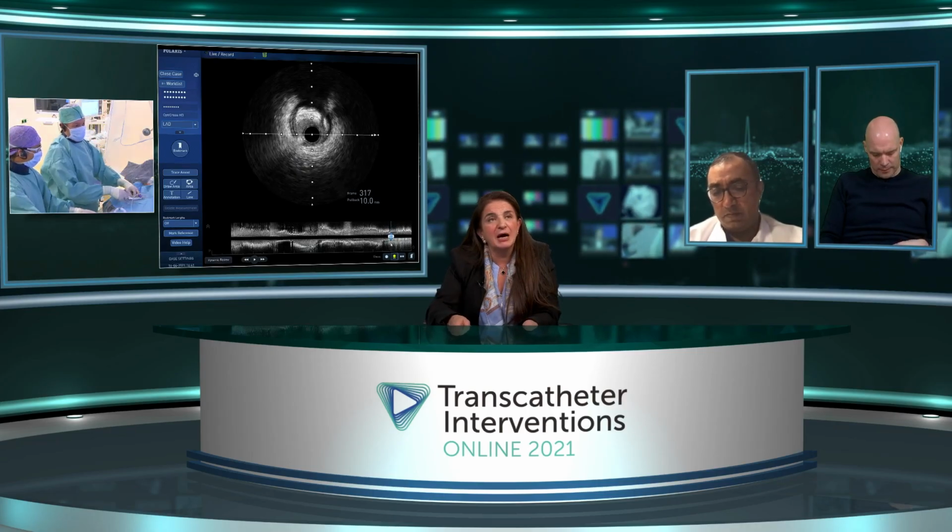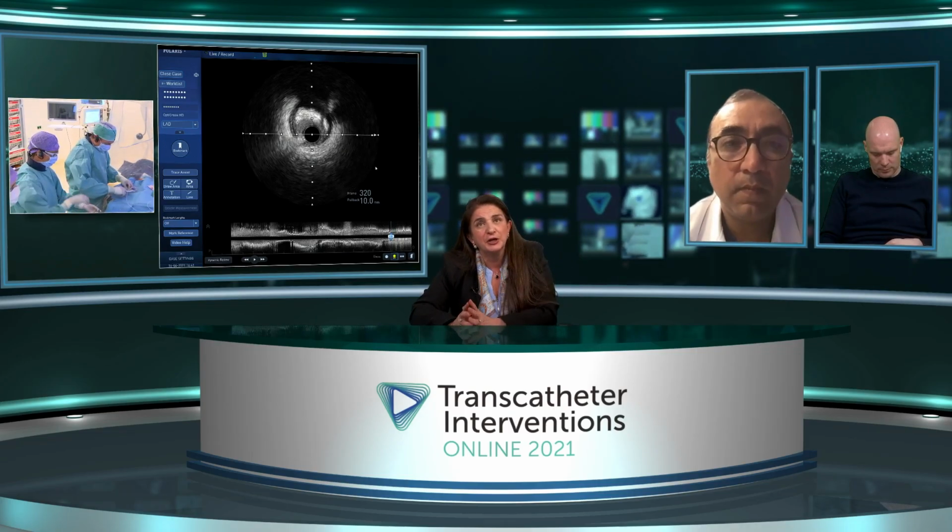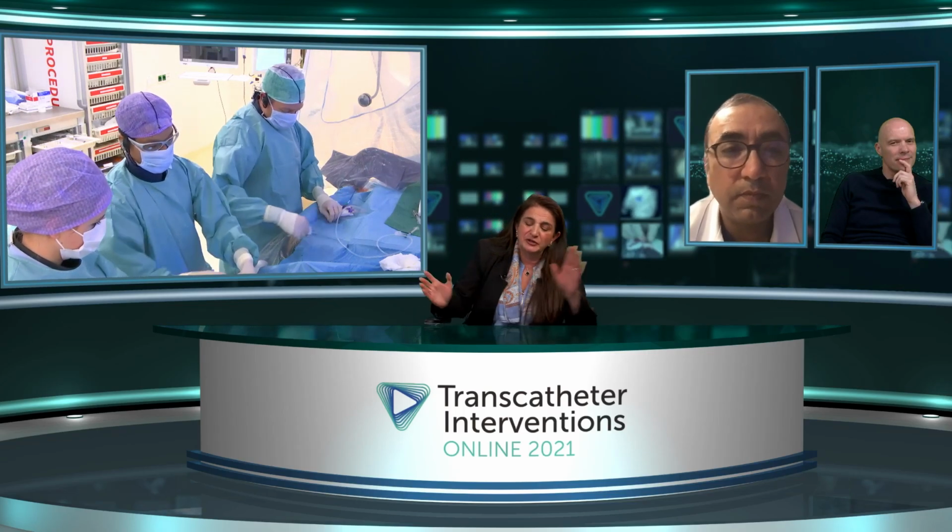That's perfect. If you don't mind, as you do this beautiful work, we're going to go back to Lars, back to Copenhagen, and come back to you. Thank you, Joost. Excellent, a wonderful demonstration of orbital atherectomy. We'll be back.